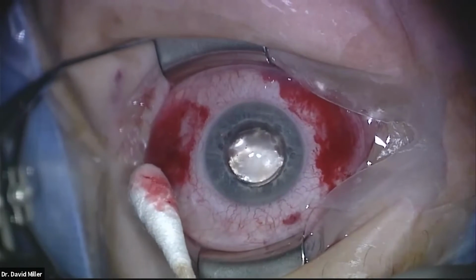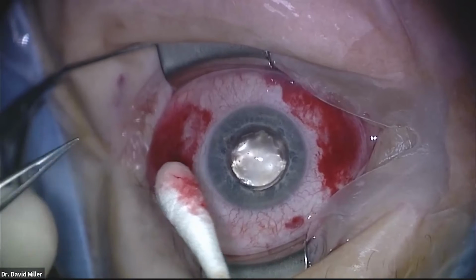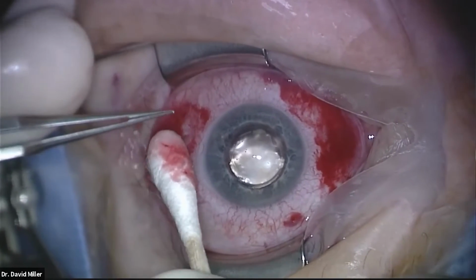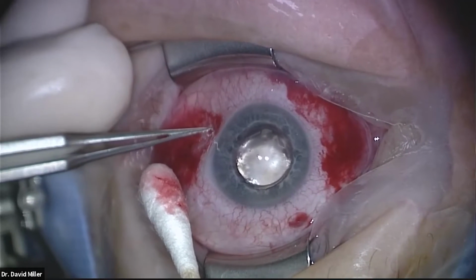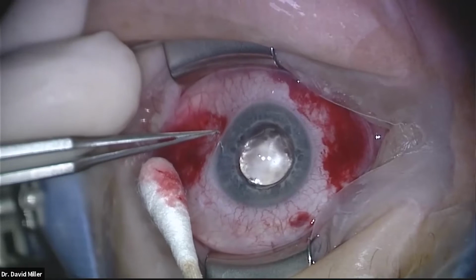But when you do get a leak like that, you've got a 0.12. You can wait just a little bit as the sclera regains its normal shape from elasticity, and the hole will close. You can see it used to be a round hole, now it's just a slit. And if we're going to press on it, we're going to press right here over the top of that tunnel. Kind of press that tunnel flat.